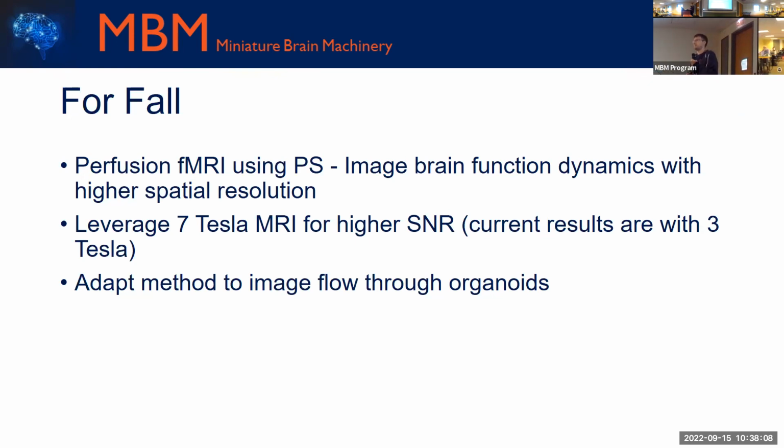And I have a second question: would the absence of cerebral vasculature in organoids change what you're looking for compared to a human brain that is active? Yeah, so what I mentioned would be for vascularized organoids. Oh, but it is a vascularized organoid. Right, but we can also think of just imaging diffusion through the organoid surface using other MRI methods. But I think with this ASL, we would want some sort of vascularization in the organoid.